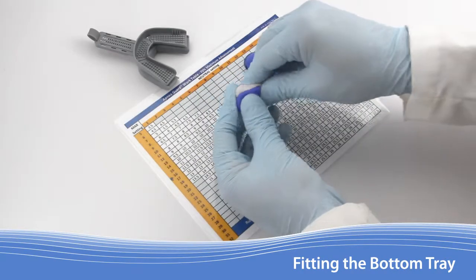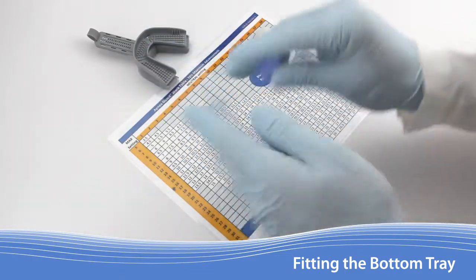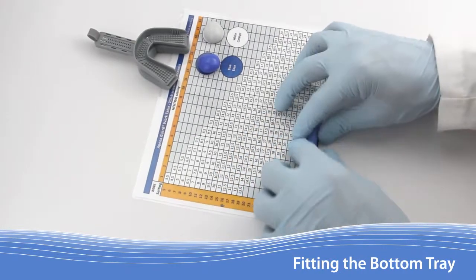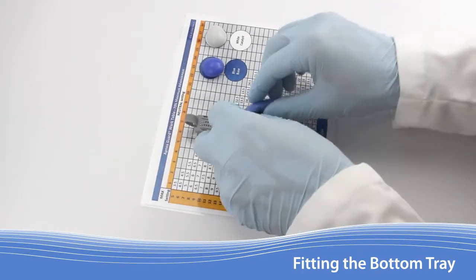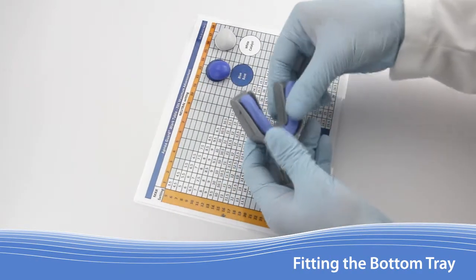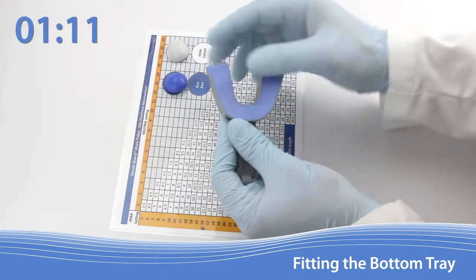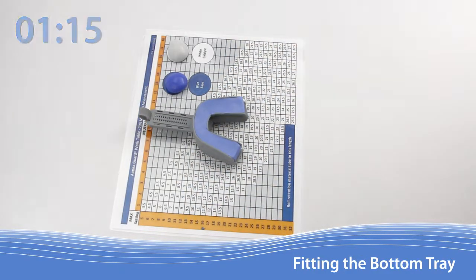Begin by kneading the blue base and the white catalyst together until reaching a uniform color. This step should take no more than 30 seconds. Roll the retention material into a tube using the Apnea Guard work table to measure the length. Carefully move the tube into the lower tray. Avoid stretching the length of the material while making the transfer. Press the material down into the retention posts. Use your thumb and finger to create a 90 degree angle on each end. Up to this point, you should have used no more than 1 minute and 15 seconds since you first started mixing the material.